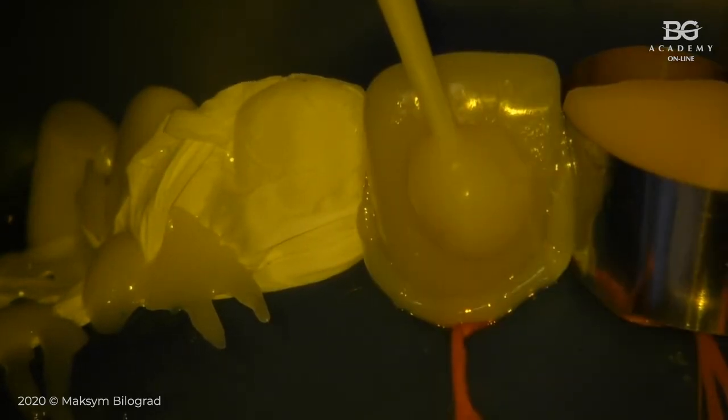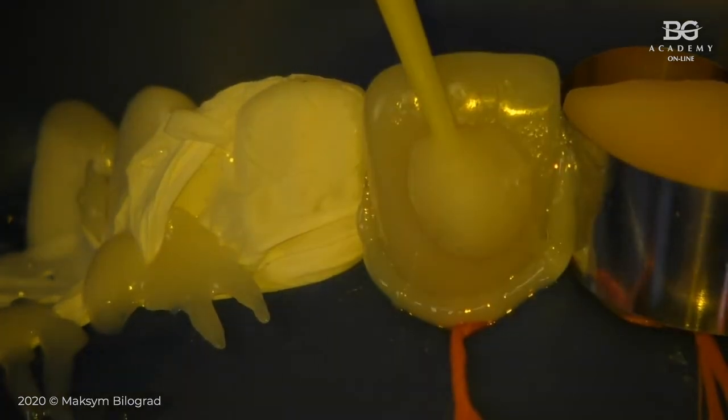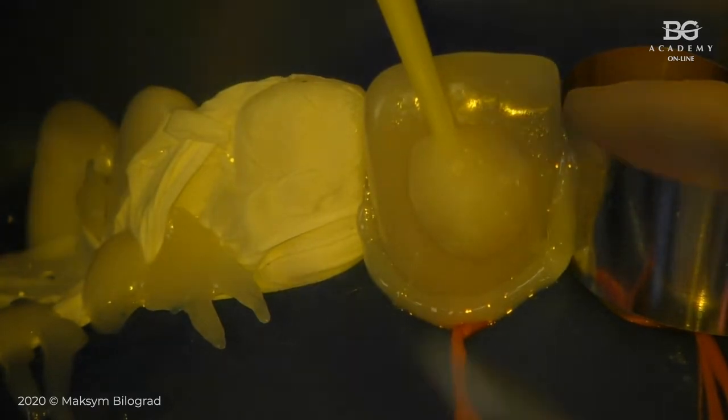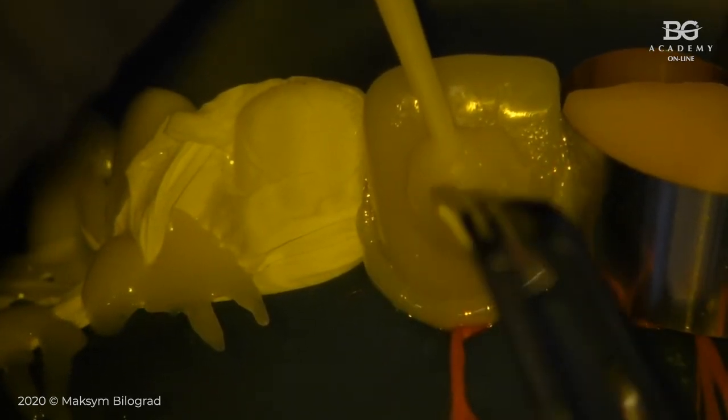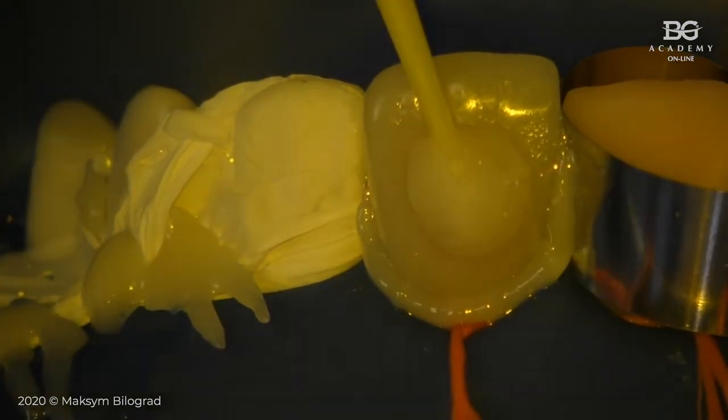See what I'm using when we are using floss ties and there is no clamp, there is no bar. You can use your finger to press gently here. But if it is not possible to use a floss tie and you're using a clamp, and you cannot get your finger between the bar of the clamp and the tooth, you may use tweezers, or a special instrument with a plastic cover to press here, and you see that we have a lot of excess of material, a lot. Okay, so it's good.